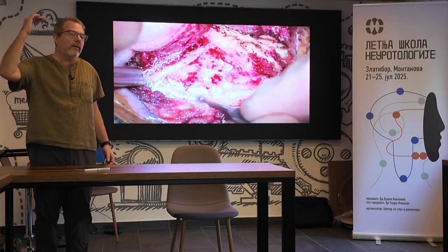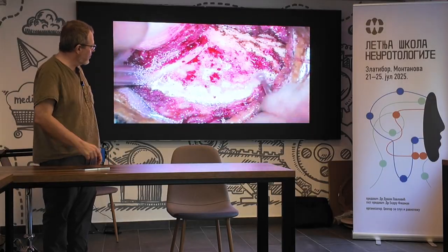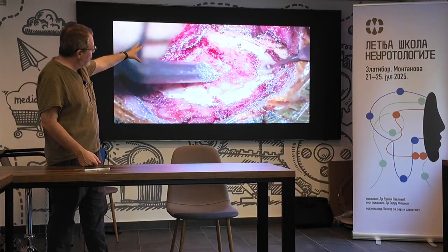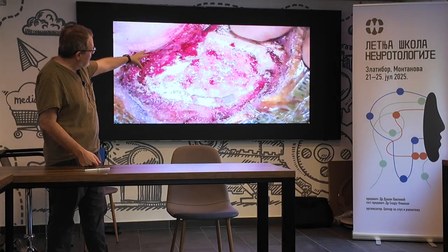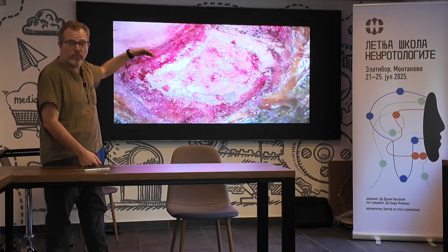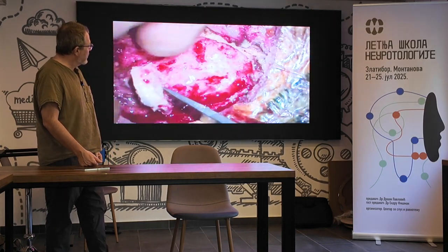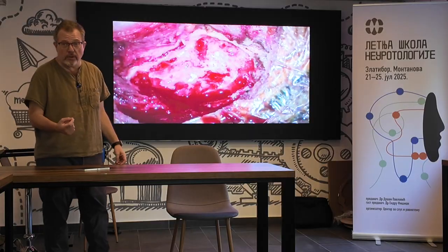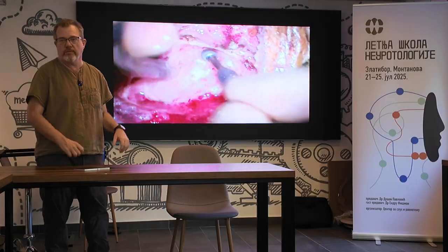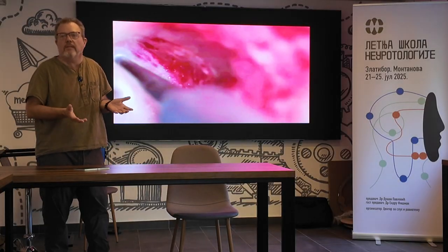Some patients require a middle fossa craniotomy, but some patients can have it done through the mastoid. And this is a minimally invasive mastoid approach. So this is a left ear, and I'm doing a mastoidectomy, and I'm keeping the bone dust, and I'm keeping the cortical surface of the mastoid to resurface the floor of the middle fossa. Because the patients with superior semicircular canal dehiscence also have defects in the tegmen, or the floor of the middle fossa. It's very common. It's kind of a developmental anomaly.